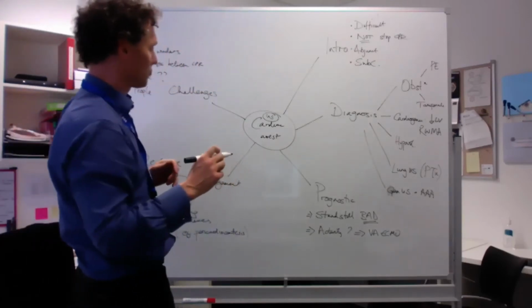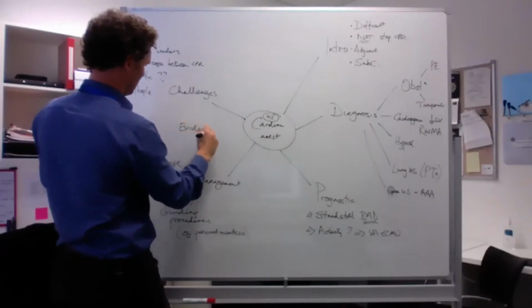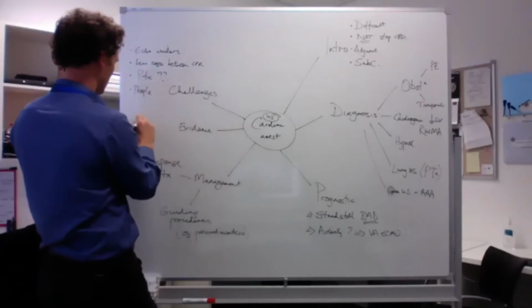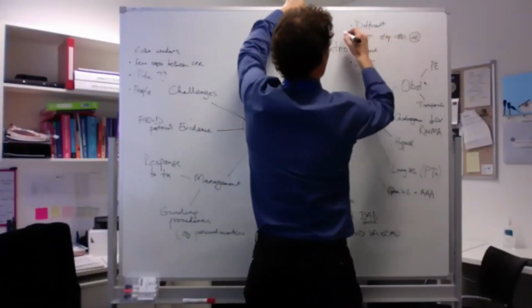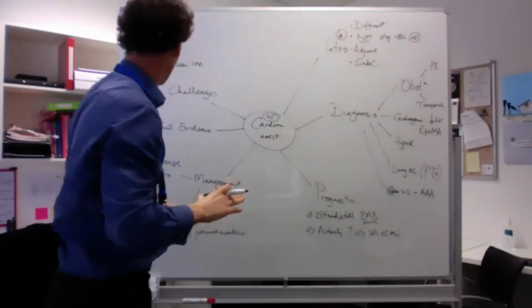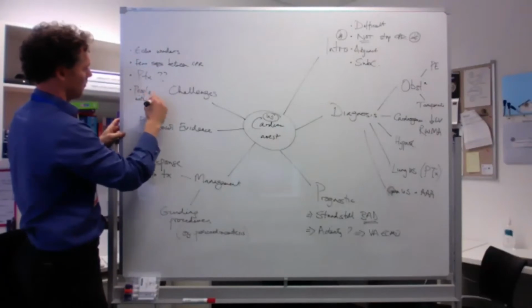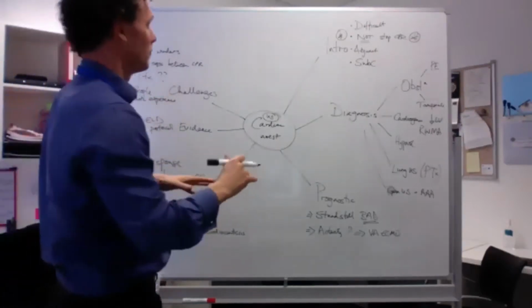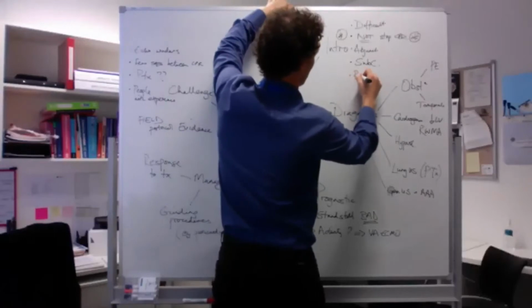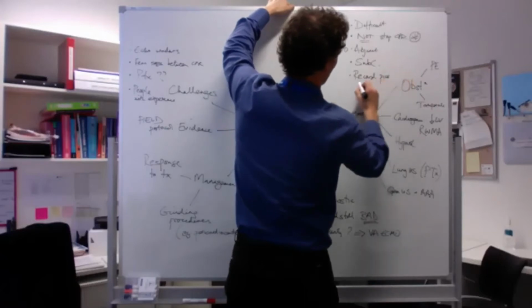So again, it's used to train people with limited training for assessment in cardiac arrest for all the reasons that you've stated. The broad outline would be that CPR should not be interrupted by echo, but there are scheduled pauses. You use the most experienced practitioner, subcostal view first, but try anywhere that works. Record prospectively, ideally for 10 to 15 seconds. Set your depth to 20 to 25 in advance, low frequency. They did a prospective trial, and they were able to get workable images in over 90% of people.